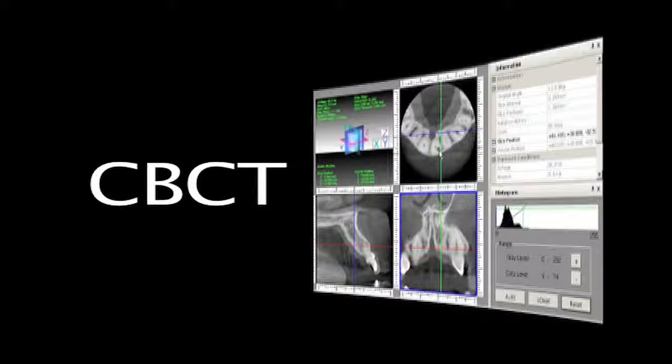The view of the tooth and supporting structures as well as the extent of bone loss are better evaluated when viewed in three independent planes.